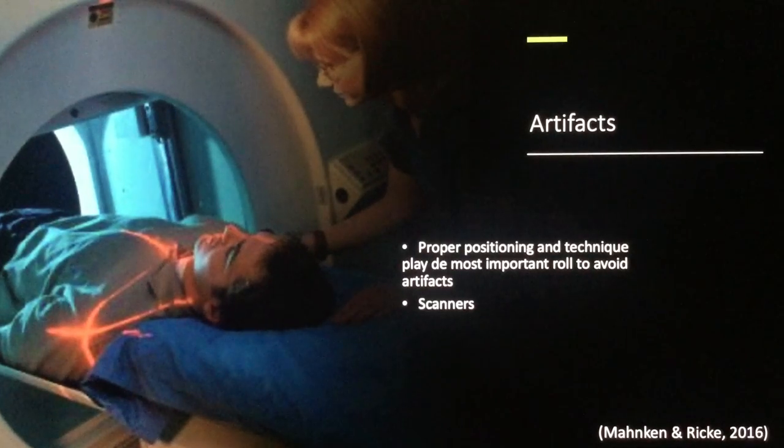Artifact-reducing design features are incorporated into modern CT scanners to minimize some types of artifacts. Some are partially corrected by the scanner software. But the most important factor in avoiding CT artifacts is the proper use of technique and the proper position.